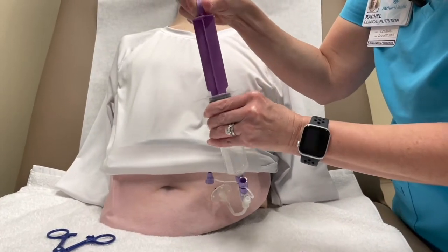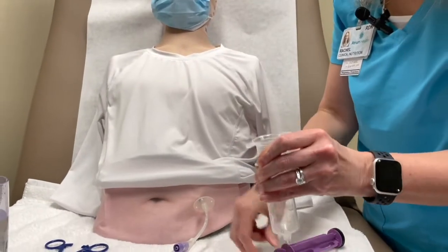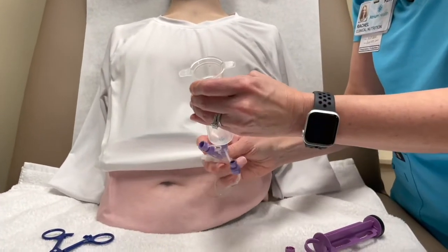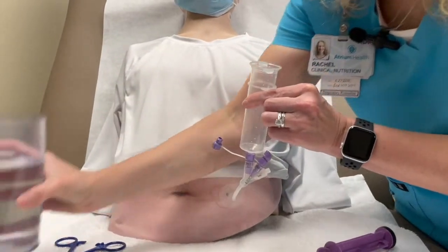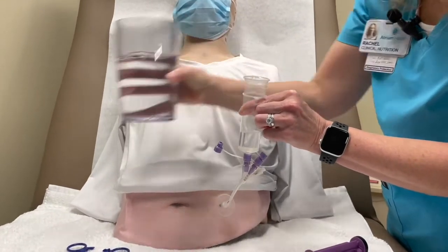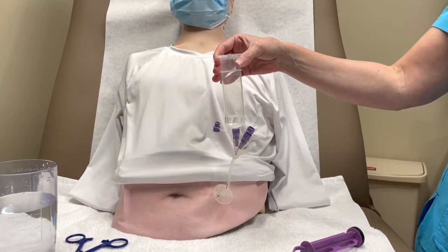The next way: just unscrew the syringe, take the plunger out, and screw the syringe back onto the feeding tube, and we can do it by gravity. You just pour the water in. Forces of nature will just let that water go right into your stomach.